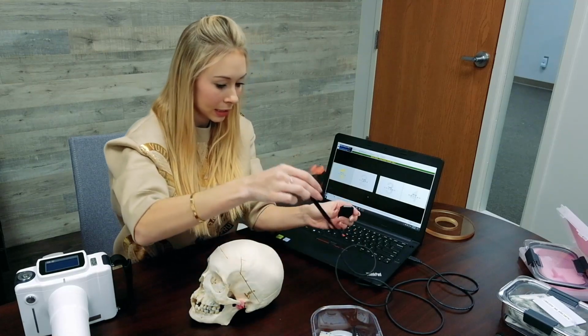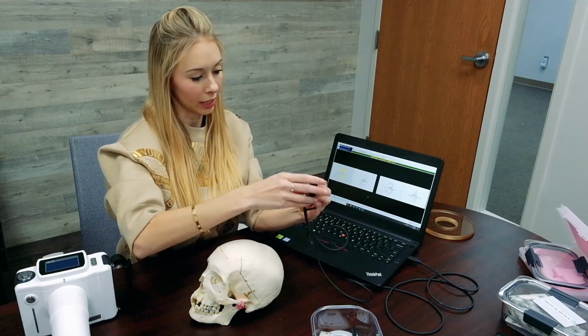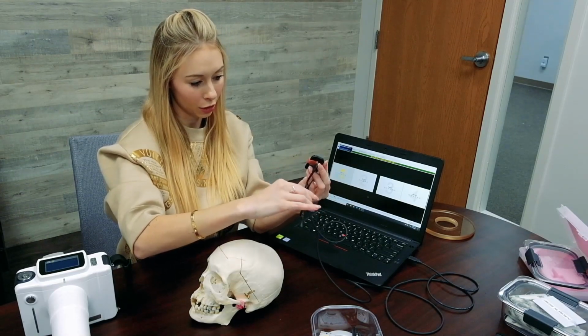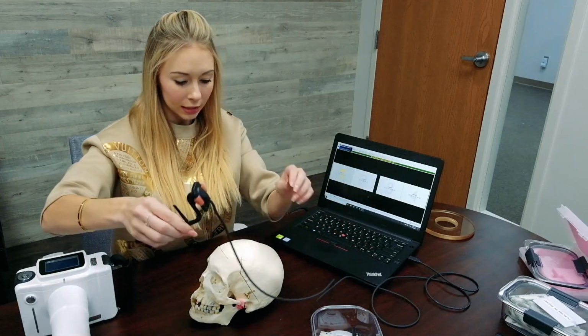So now I'm going to go ahead and place the sensor within the red sensor holder for the bite wing series. I'm going to hold that. So we're going to slide the sensor into this holder like so, making sure that the sensor cable is lined up with the back of the sensor holder. That'll ensure proper placement.